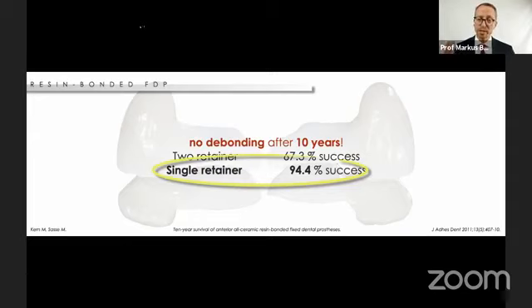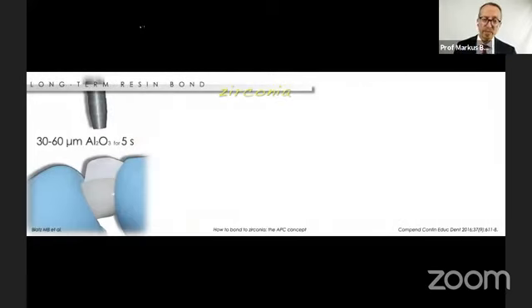It starts, of course, with a minimally invasive prep. Do not remove too much enamel. Keep it very little. And if you have enough space, you have almost no preparation. Keep one retainer. Don't connect it to the other tooth, because that may break more easily. And then air abrasion is the first step of your bonding protocol.